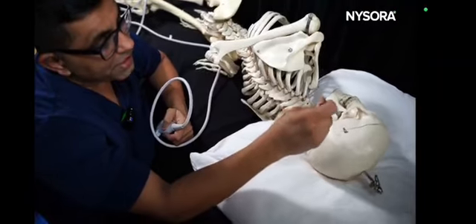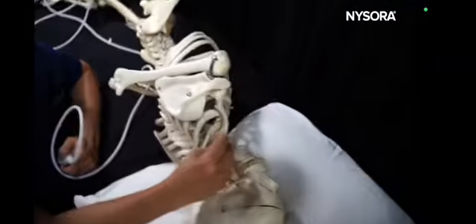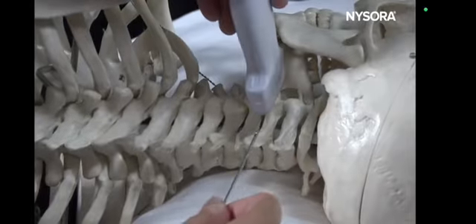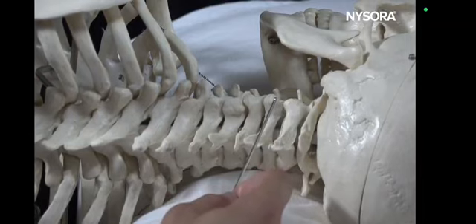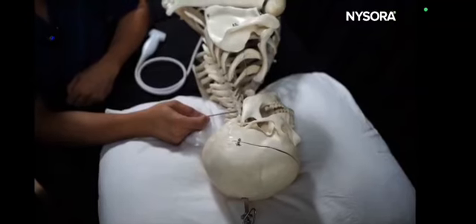The injection technique will be out-of-plane going from anterior to posterior, or you can do a transverse view and go in-plane from posterior to anterior, landing in the area which we call the articular pillar. Then you will use X-rays if you're performing radiofrequency treatment to confirm and fine-tune the position of the needle. Thank you.